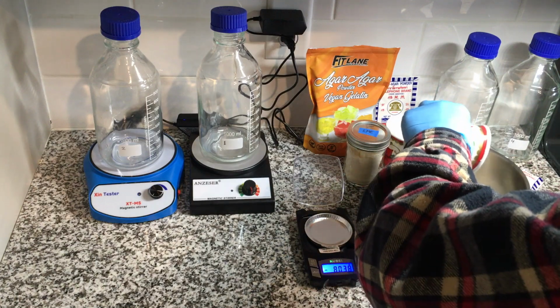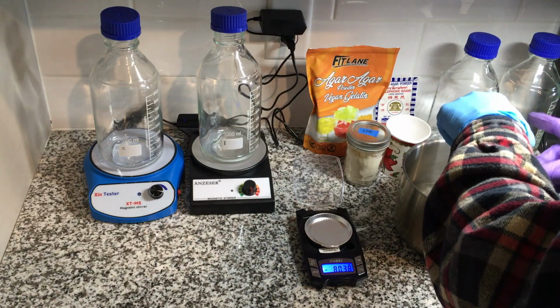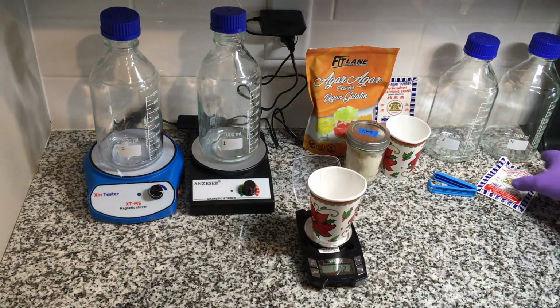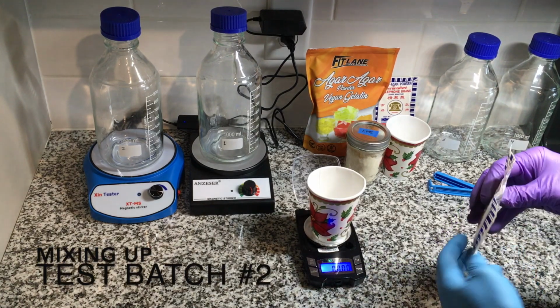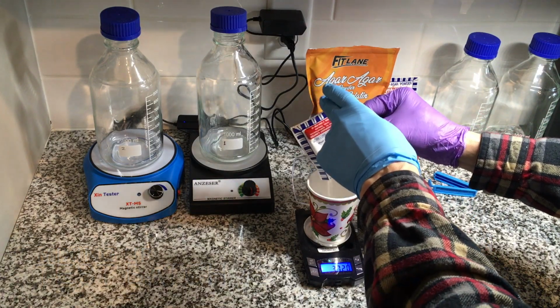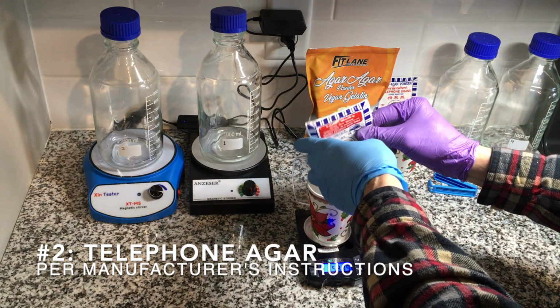I had been making telephone agar in a pan on the stove, and then I saw a post that you could save time by placing the dry ingredients into a media bottle, add the water, cap, and go directly into the pressure cooker. Let the boil mix the ingredients. So I adopted that. I switched to hot water in a bottle, dumping my telephone ingredients in, cap it, put it in the PC, let the boil mix things up. Never made any notes about when I made the change.